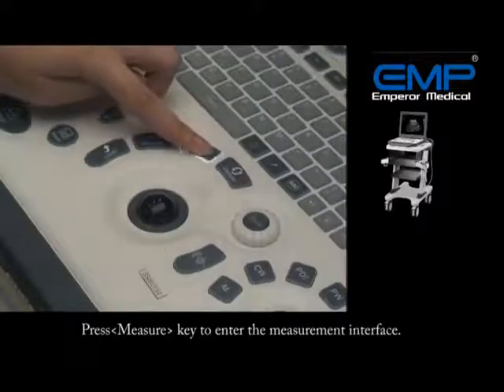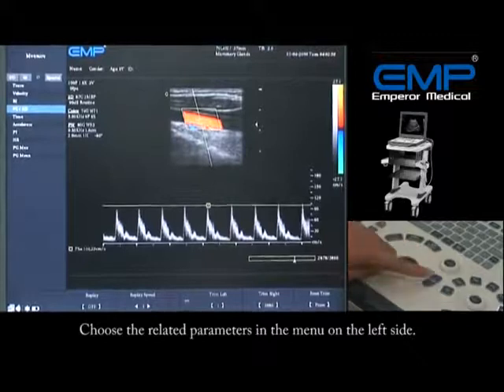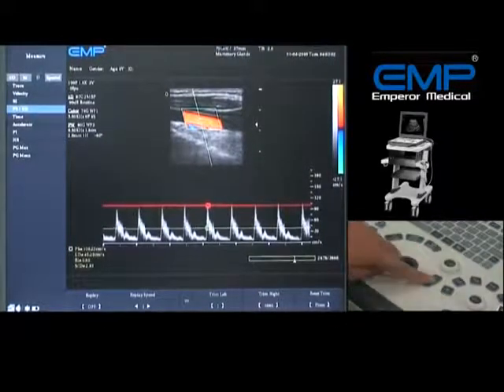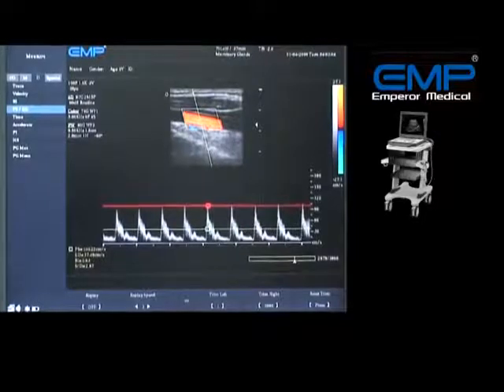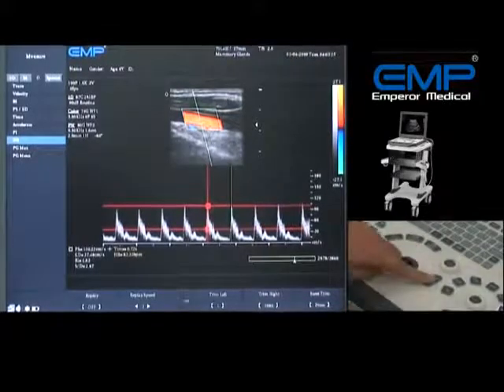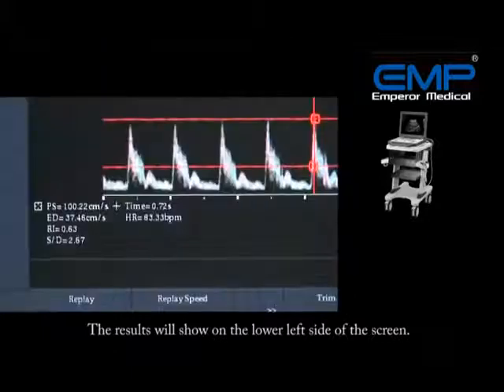Press the Measure key to enter the measurement interface. Choose the related parameters in the menu on the left side. The results will show on the lower left side of the screen.